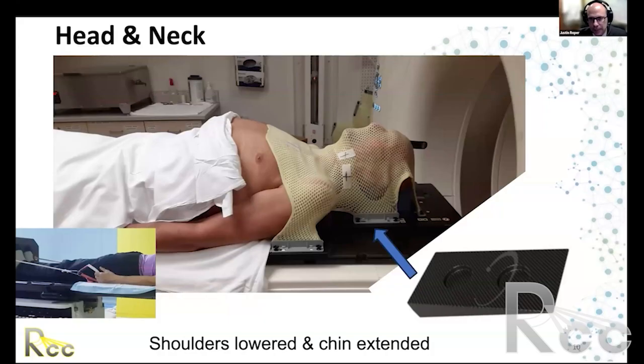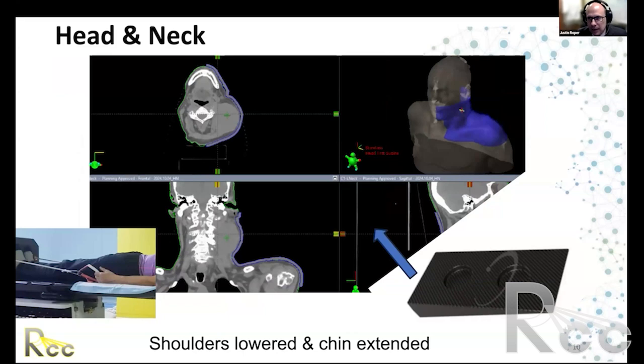Next slide, please. So head and neck patients may have disease which extends close to the skin surface. And when treating with photons, that superficial disease could be in the build-up region where dose is lower than what it is at Dmax and beyond. And so in order to get adequate dose brought more superficially to cover that superficial disease, bolus could be used.